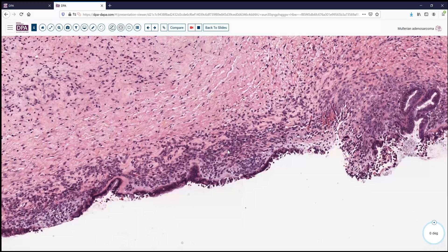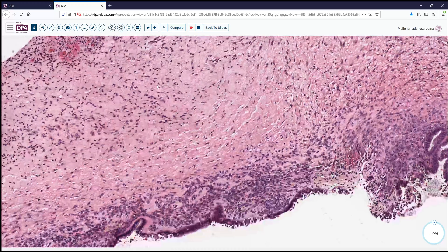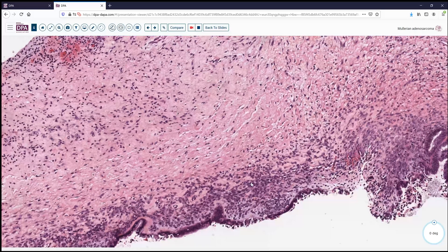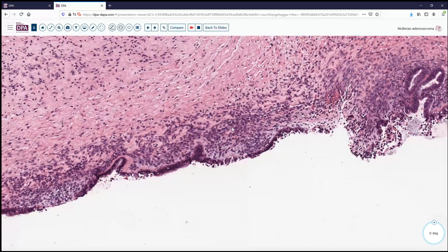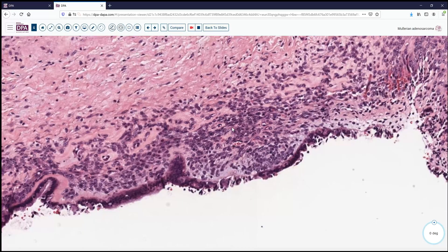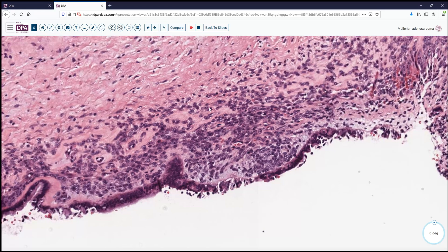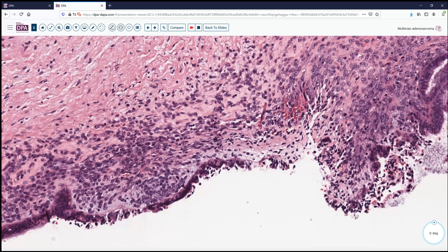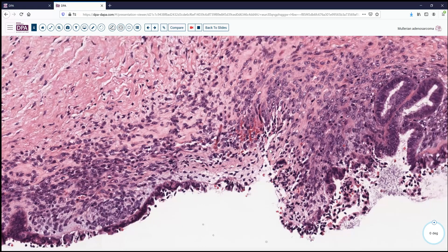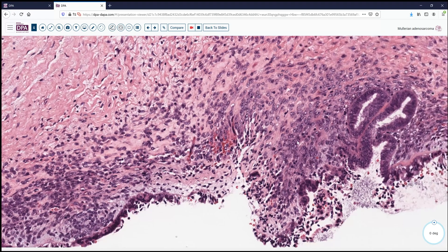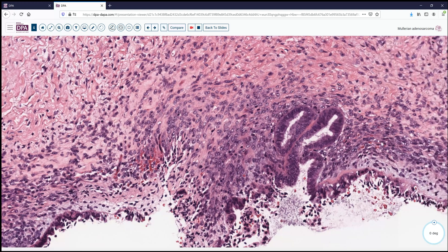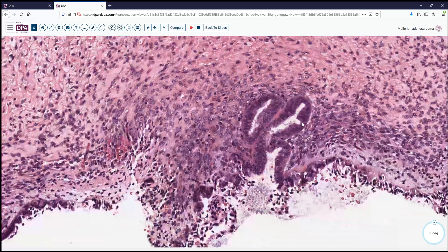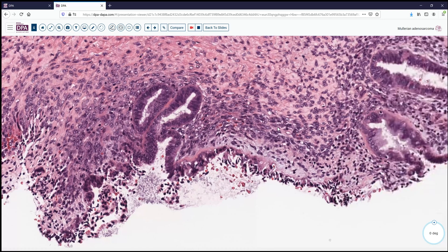The pinkish tissue here does not appear to be smooth muscle, and we have a very delicate vasculature. The cells in the stroma are not highly atypical, but as we look around, we can see that there are occasional mitotic figures in some of these areas, going along with a proliferative process.